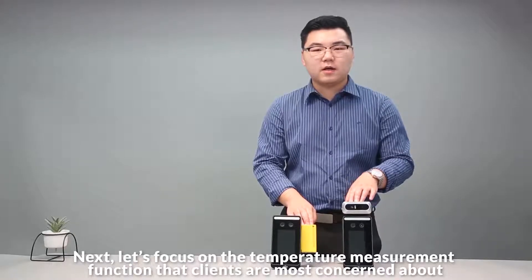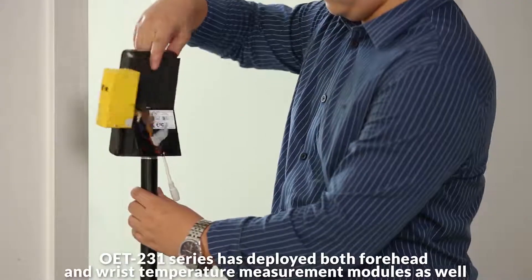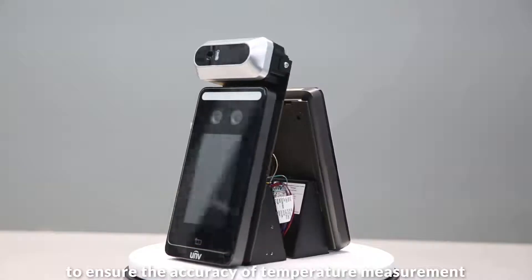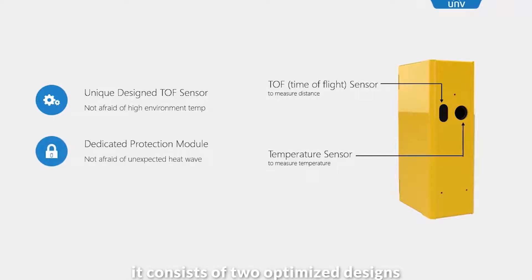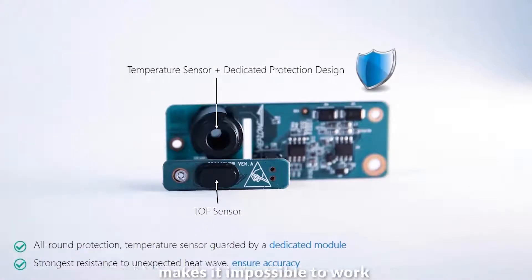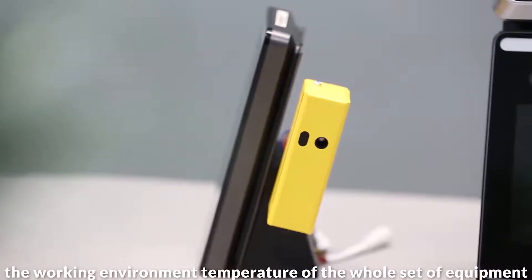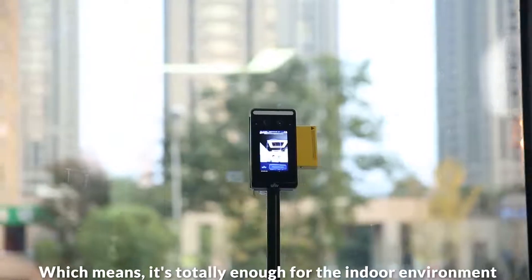Next, let's focus on the temperature measurement functions that clients are most concerned about. Like other UNV ThermoPile solution products, the OET-201 series has deployed both forehead and wrist temperature measurement modules. The UNV forehead temperature module adopts world-class sensors to ensure accuracy. The wrist temperature module consists of two optimized designs: a TOF sensor, which measures distance through intelligent algorithm, and a special protection module which protects the temperature sensor, making it possible to work even when ambient temperature is close to the target temperature. With these two special designs, the working environment temperature of the whole equipment can reach up to 40 degrees, which is totally sufficient for indoor environments.